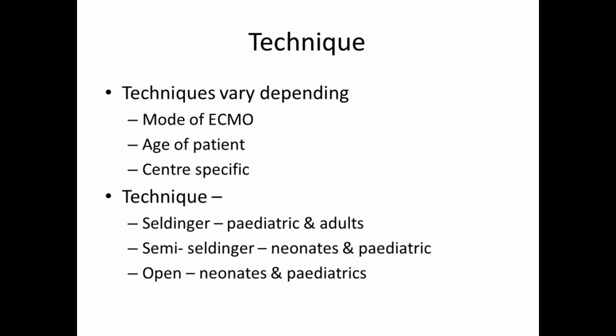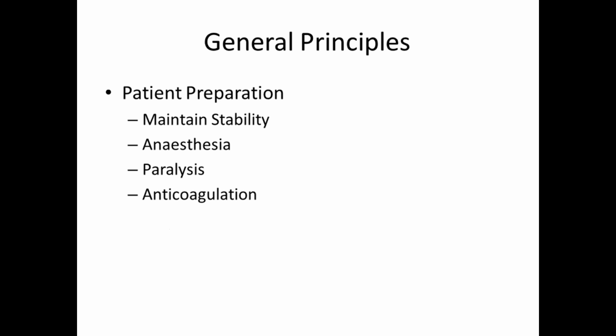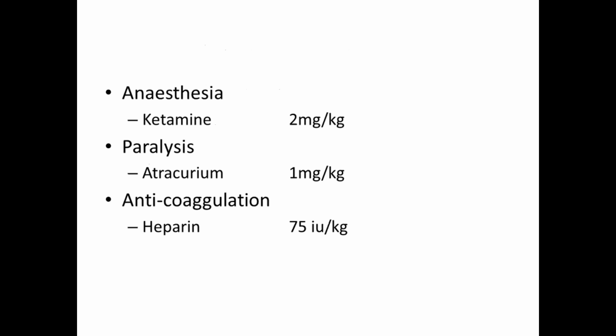Techniques may depend upon the mode of ECMO you want to plan, the age of the patient, and the center. Technique can be Seldinger, semi-Seldinger, or open. In general, you prepare the patient and maintain stability. If required, give some sedation and anticoagulation, keeping safety in mind.